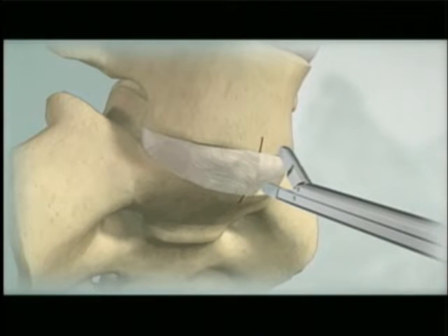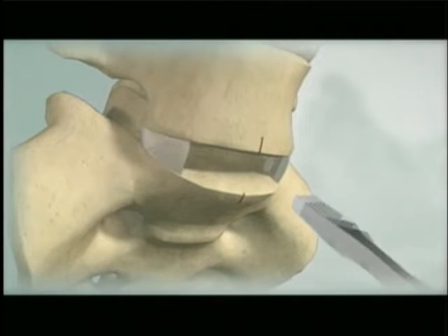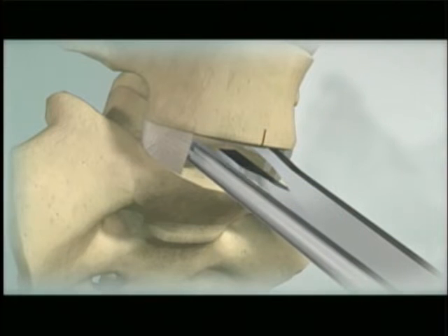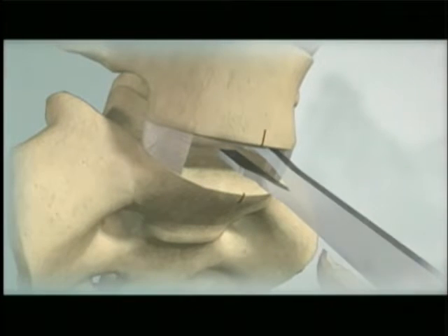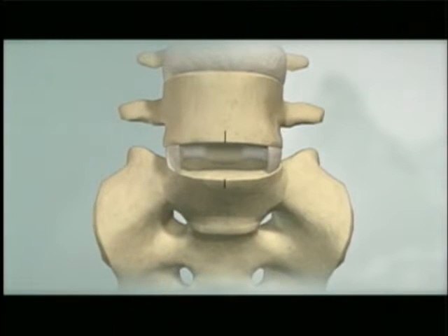Perform a thorough discectomy using the bone elevator and standard rongeurs, kerrisons, and curettes, ensuring the posterolateral corners are free of disc material. Insert the vertebral body spreaders to the posterior margin of the vertebral bodies to gradually remobilize the motion segment. The posterior longitudinal ligament should be completely exposed and released or resected as required to achieve remobilization.